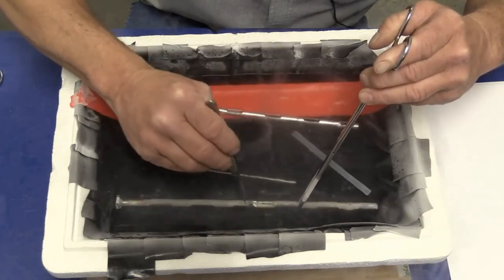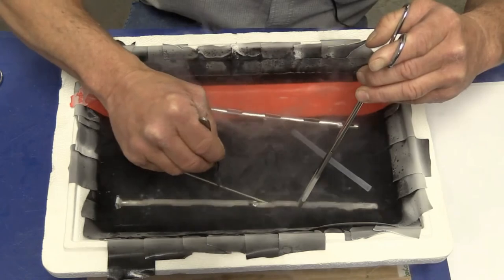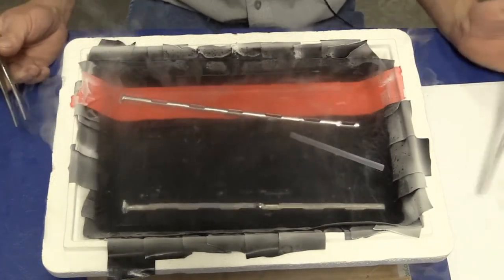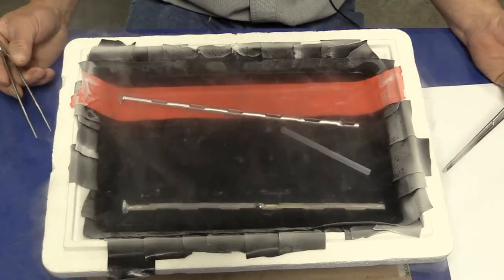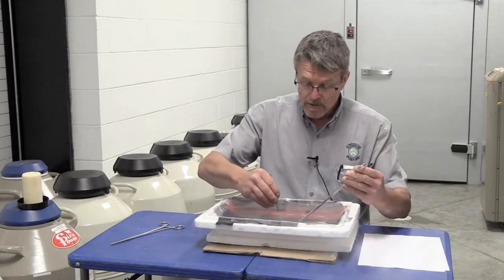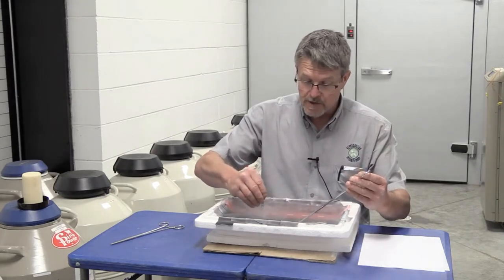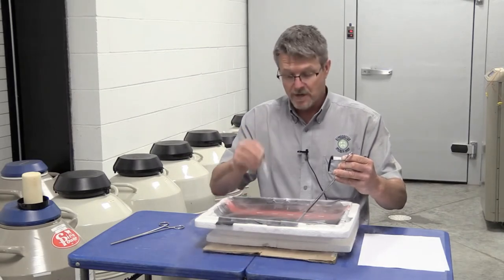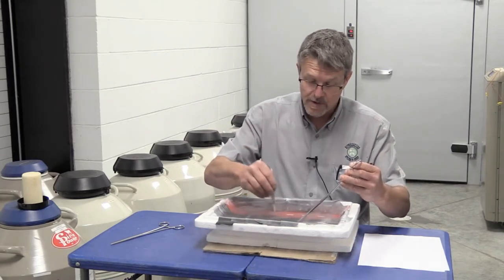We would prefer that you put the crimped end of the straw into the goblet first. By having the cotton plug out, when you partially remove that straw, that's how the writing is laid out on that straw so you can read it without having to remove the whole straw from the goblet.